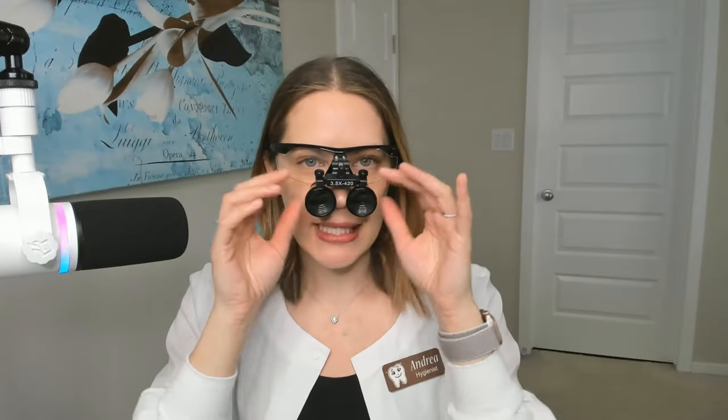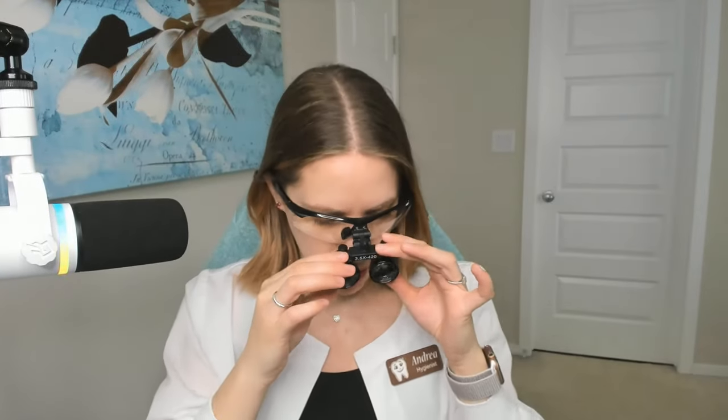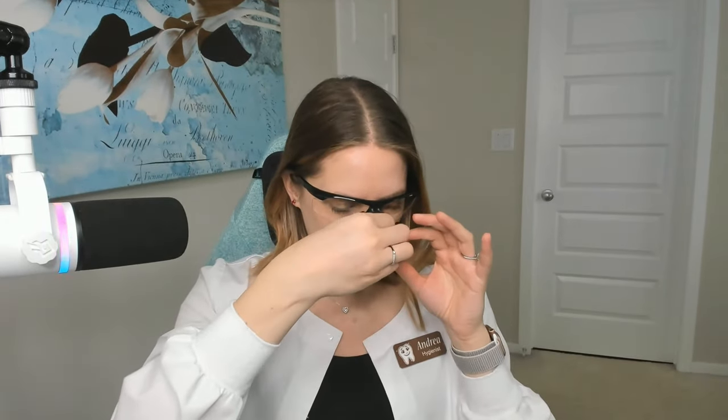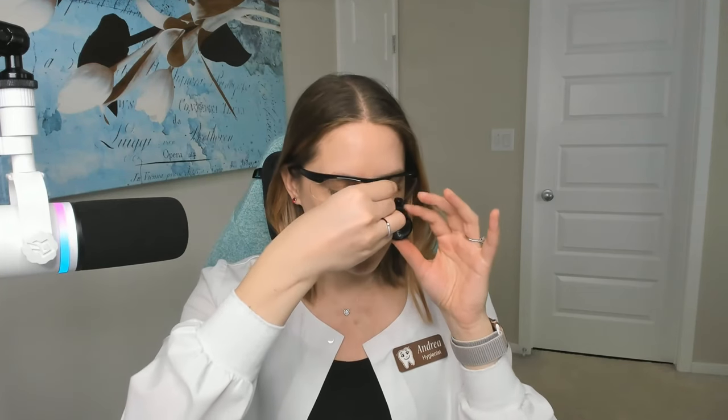I find when I sit down, because these are obviously going to be in the case, when I sit down, put them on before my patient, I do just have to adjust them, because every patient is different. Some are going to be higher in the chair, some are going to be lower. You're going to need to adjust them, probably switch this up a little bit too. Think where you are going to want to sit, and then you're all good to go. So don't put on any gloves until after you do your adjustments.